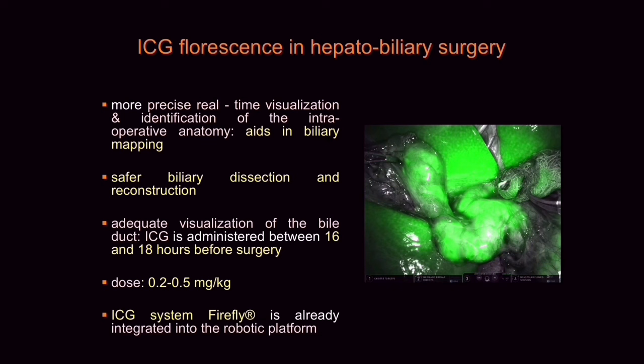ICG fluorescence in hepatobiliary surgery is used for biliary mapping as it results in precise real-time visualization and identification of the intraoperative anatomy. ICG fluorescence helps for safer biliary dissection and reconstruction. Adequate visualization of the bile ducts can be achieved when ICG is administered between 16 to 18 hours before surgery. The dose is usually 0.2 to 0.5 mg per kg. The ICG fluorescence system, the Firefly, is already integrated into the da Vinci robotic platform.